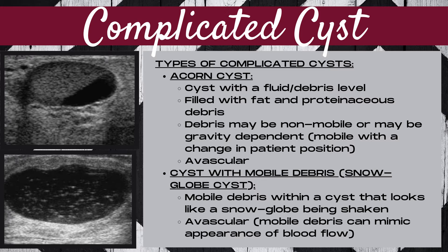The next type of complicated cyst is a cyst with mobile debris, often nicknamed snow globe cysts. The mobile debris within the cyst looks like a snow globe being shaken up — the debris is moving on its own, almost like it's snowing within the cyst. A cyst with mobile debris should be avascular, although because of so much debris motion, the mobile debris can mimic blood flow when using color or power Doppler.